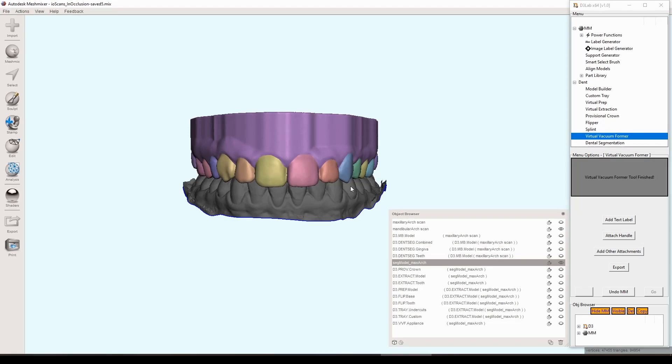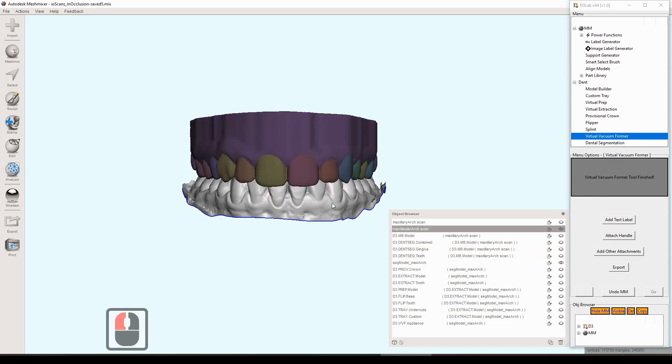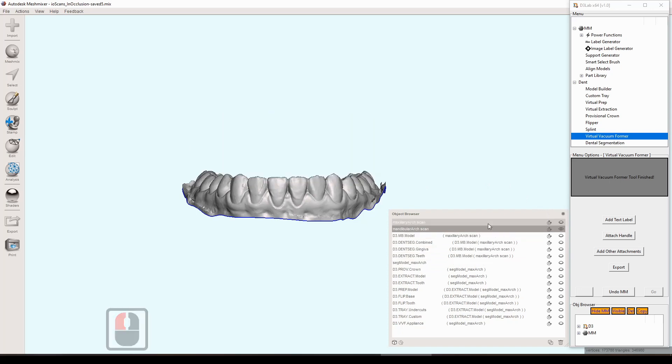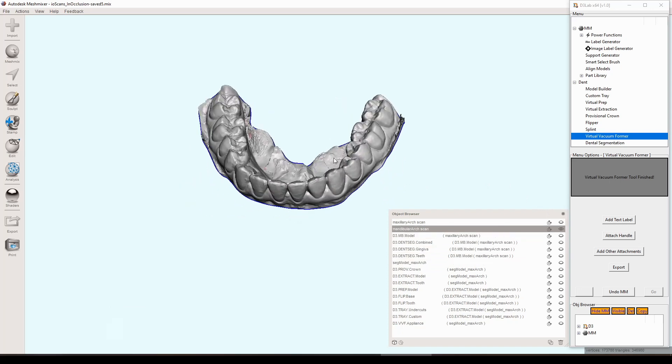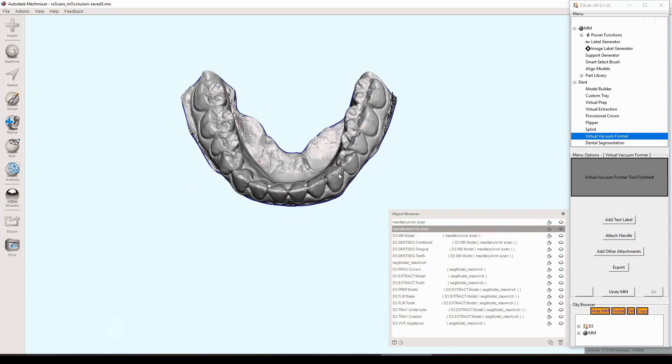The first thing we'll do is quickly base the opposing arch that we had from earlier. The reason we're doing that is just so we have something that we can put those freshly generated image and text labels on.